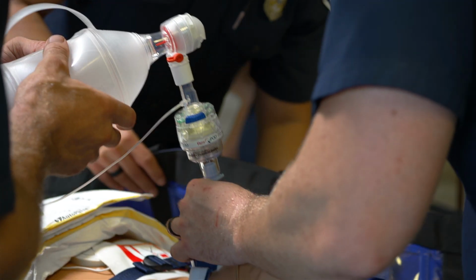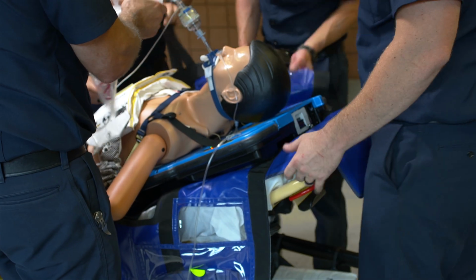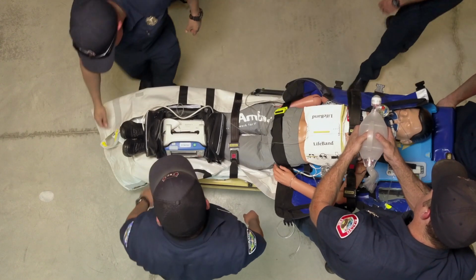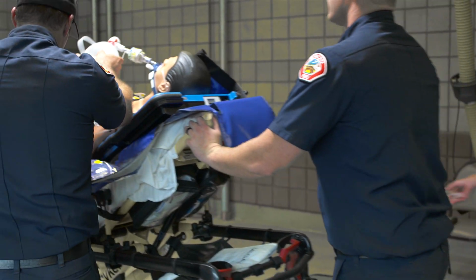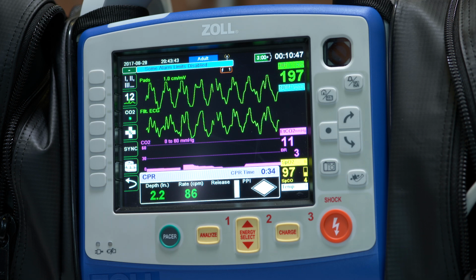You'll notice that immediately after we've intubated our patient and placed them on the end-tidal CO2 and the rescue pod, we'll sit them up. So we base our defibrillation choice on where the patient is with their capnography. We use capnography to basically measure where we are with pH, and we have to get the pH and the saturation of the heart and the blood straightened around before the heart's ready for defibrillation.